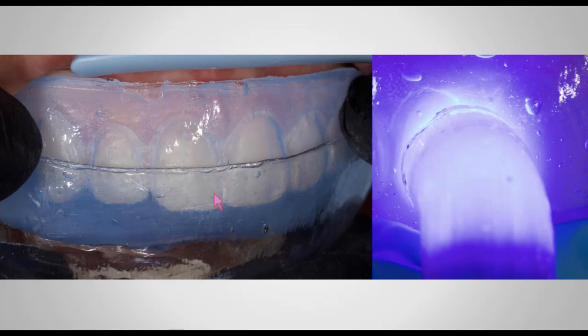So if you were to remove the clear triad and the clear PVS at the same time, you would deform your flowable composite. So you want to make sure that you remove the clear triad, you leave the clear PVS inside, and then you light cure one more time, 20 seconds per tooth, only on the facial aspect. In this particular case, these are composite veneer prototypes.